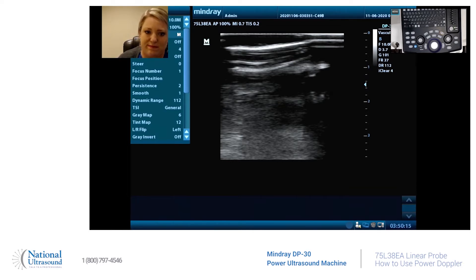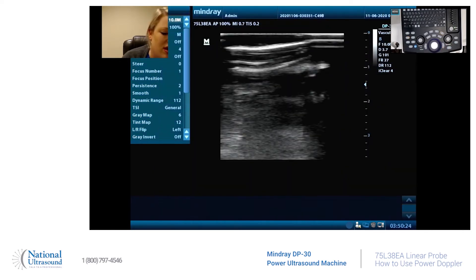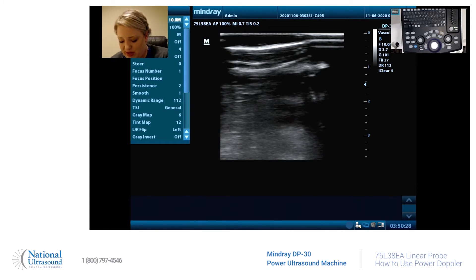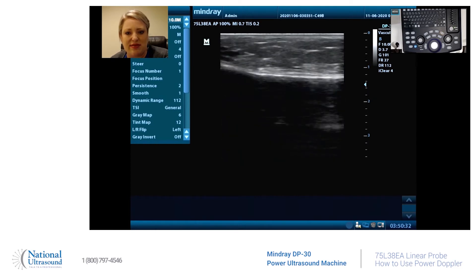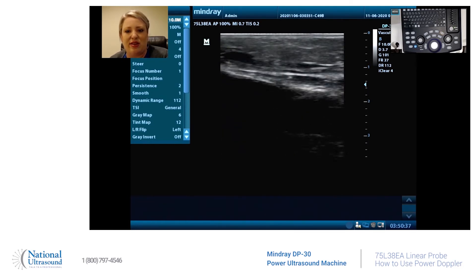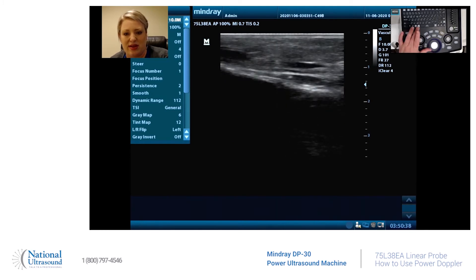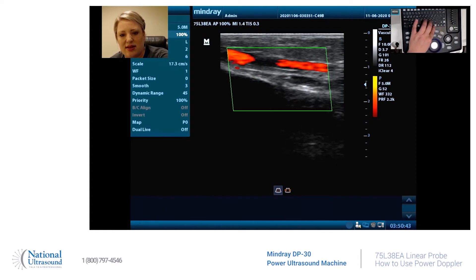First, selection of the probe — we're using a linear probe, we're just going to hit vascular. This Mindray DP30 has power Doppler; it doesn't have color Doppler, but as you know, power Doppler is a lot more sensitive. So let's look at the blood flow in the lower extremity — power on, let's see what we got.